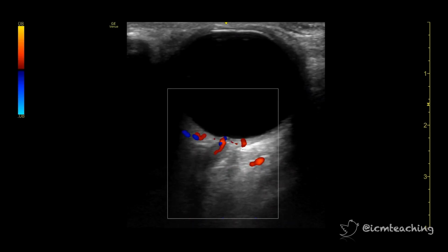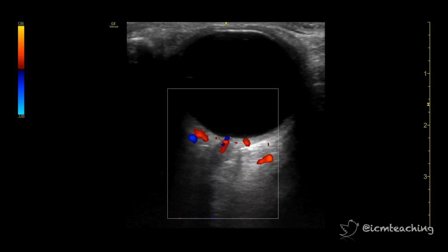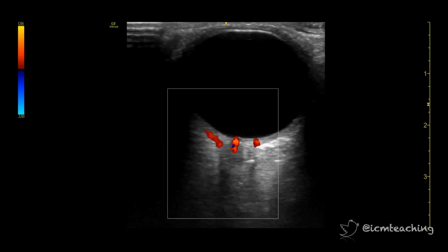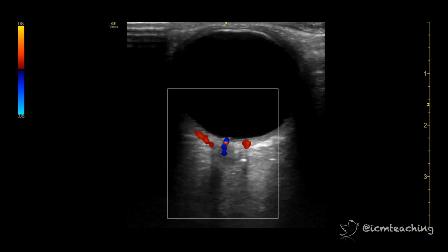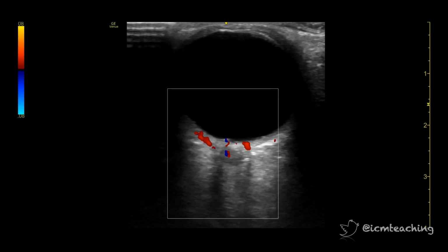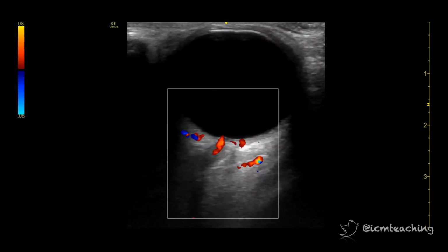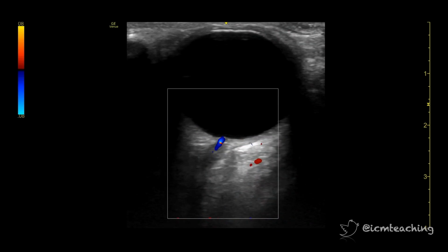If we add coloured Doppler to the scan, so we can see the blood flow in the central retinal artery and vein, this helps us see the nerve changing position even more clearly. And this confirms that we are looking at the optic nerve. We can see again how the course of the nerve appears to completely change depending on the angle we are looking at it. Here it starts by travelling to the left of the image, moves centrally, and then travels off to the right as I change the angle of inclination.